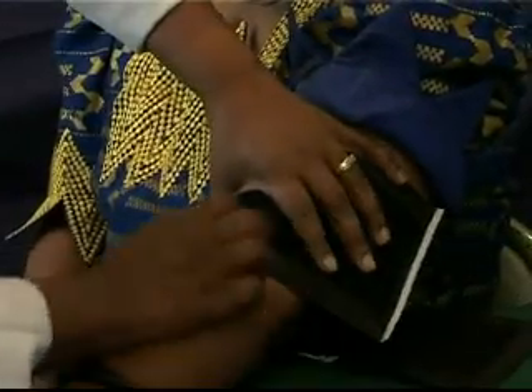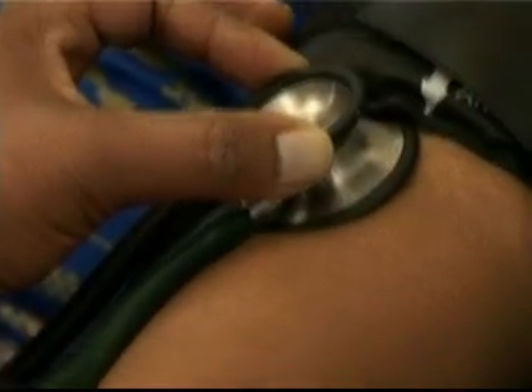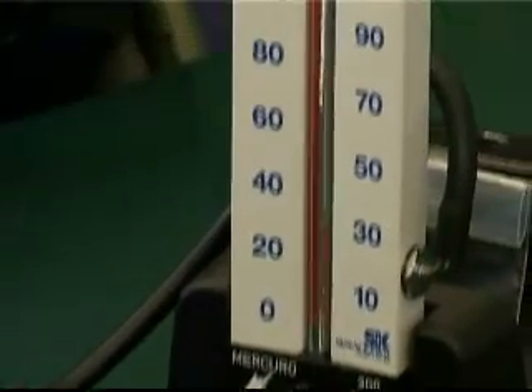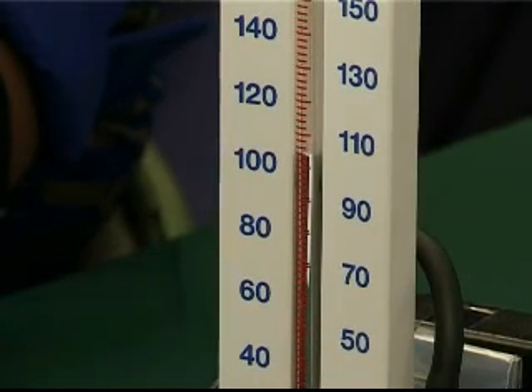There are two methods for measuring blood pressure. With the palpation method, we put a finger on the brachial artery to determine the approximate systolic pressure and the pulse rate. With the auscultatory method, we listen for the five phases of Korotkoff sounds whilst observing the slow descent of a mercury column or a needle dropping against the scale of a sphygmomanometer.